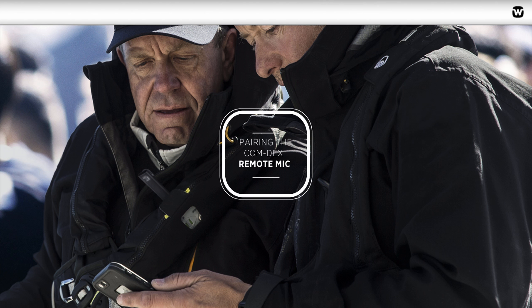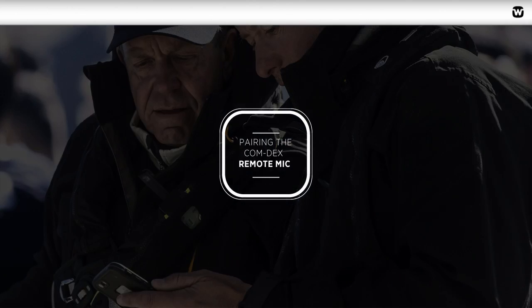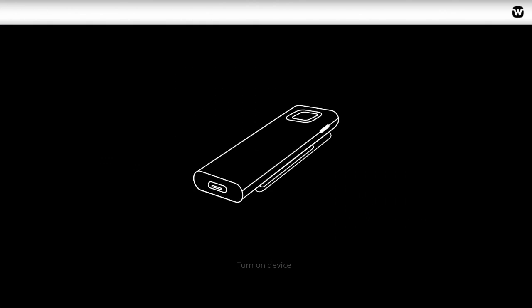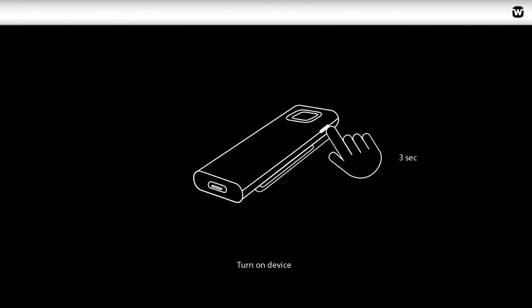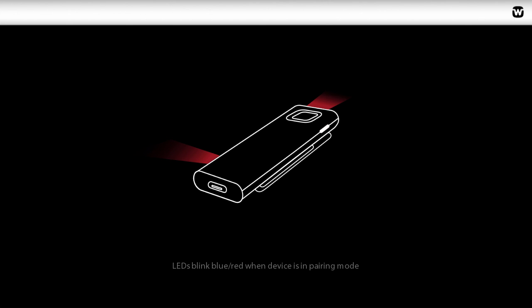Pairing the Comdex Remote Mic. Turn on your Comdex Remote Mic by pressing down the power button for 3 seconds. The first time you do this, it will be set in pairing mode, and it will automatically connect to your Comdex.